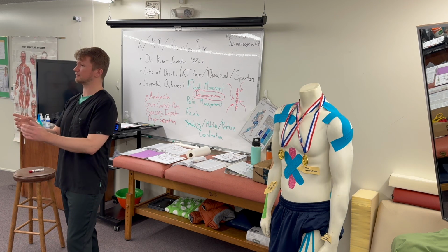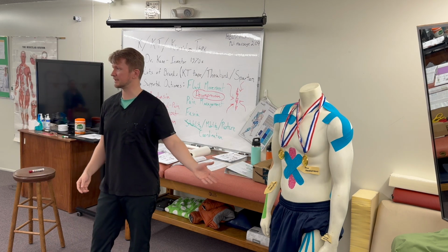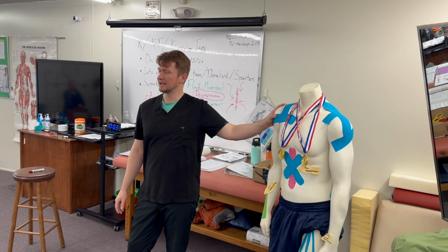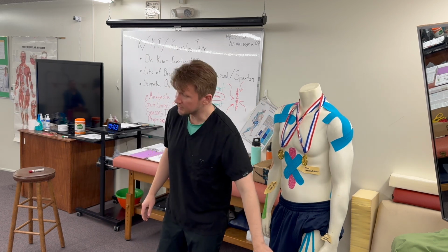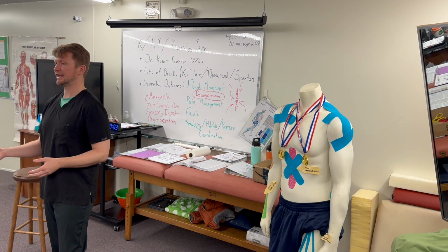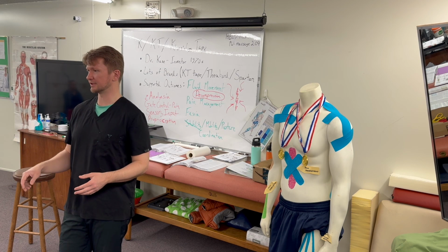The only problem with the cups is sometimes they're hard to get on certain body areas. So that's where the tape could have additional value. Where the tape has the big win is it can sit there for days. Especially for swelling, edema, lymphatic fluid, it can be sitting there, especially for the lower leg. And the homework of the person now is, when you're sitting, make sure you're wiggling your foot a little bit.